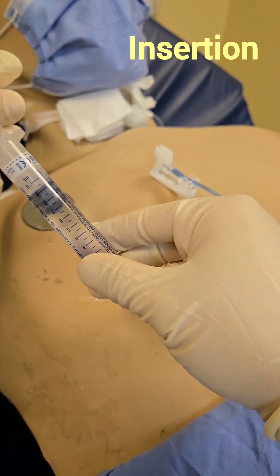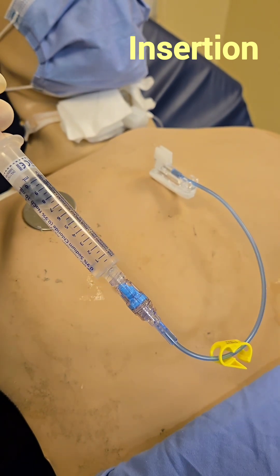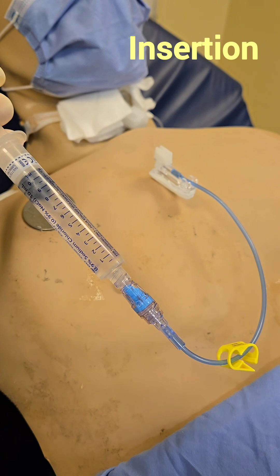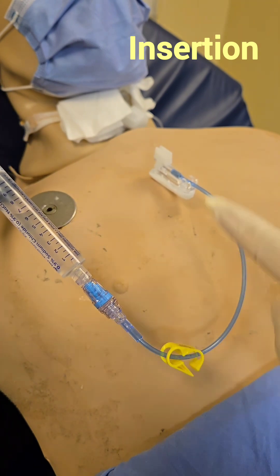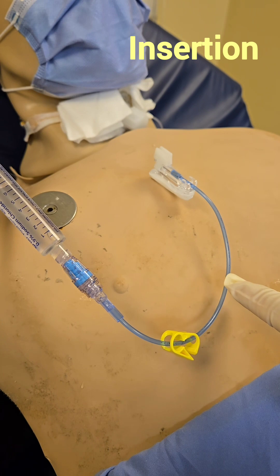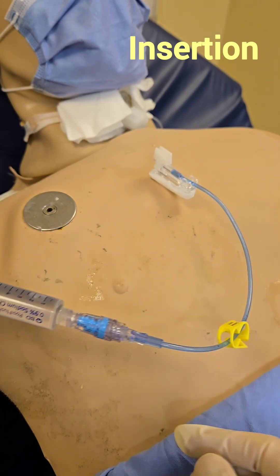If, for example, it's at 7 cc's, check if any fluid comes up. Imagine if that were blood — the line would fill up with blood. You don't need to aspirate the whole line; as long as you see some blood, you're good.